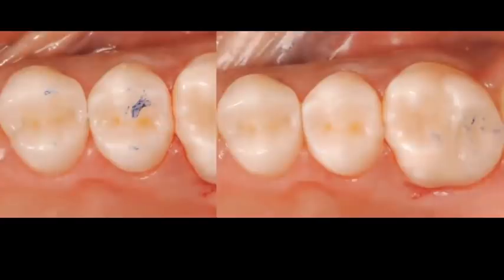When you build teeth using these techniques, you will notice that your occlusal adjustment is going to be a lot less. Because think again, if you were to place two horizontal layers, you're going to end up with a flat restoration, and it's going to be an over contour restoration right in the central fossa. With this technique, you're actually building your central fossa from the get-go. So there's very little for you to do when it comes to occlusal adjustment, but most importantly, there's less need for you to use multiple burrs in order to get this anatomy.